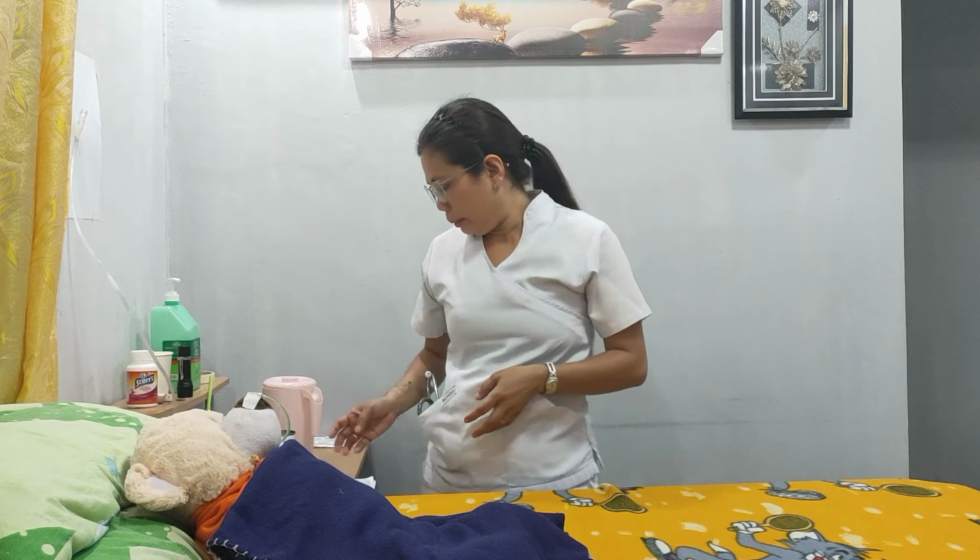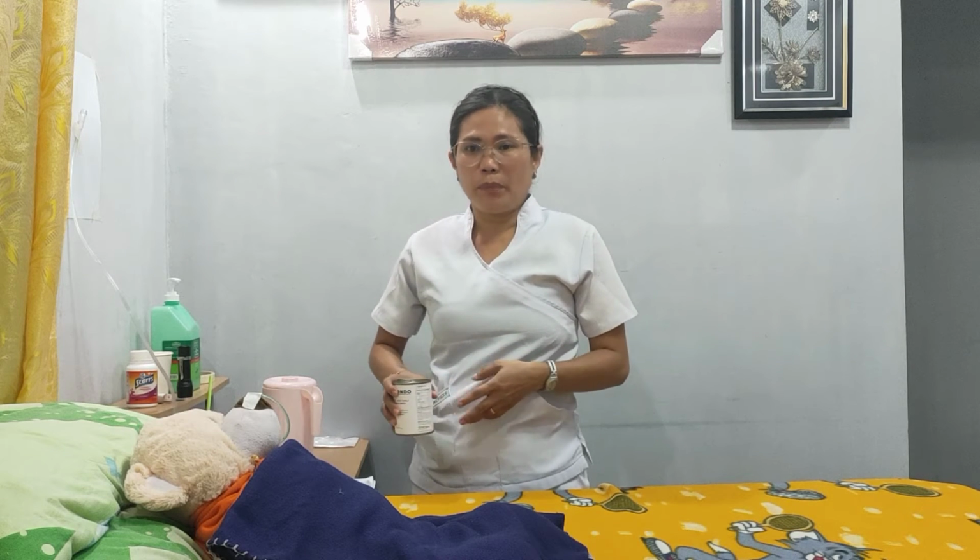Today, we will be using a canned formula. Remember to check the expiration date, because the feeding solution may settle and require mixing before administration. Outdated formula may be contaminated or may have lessened nutritional value.